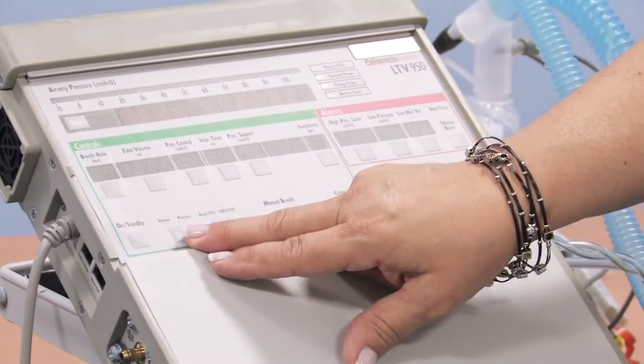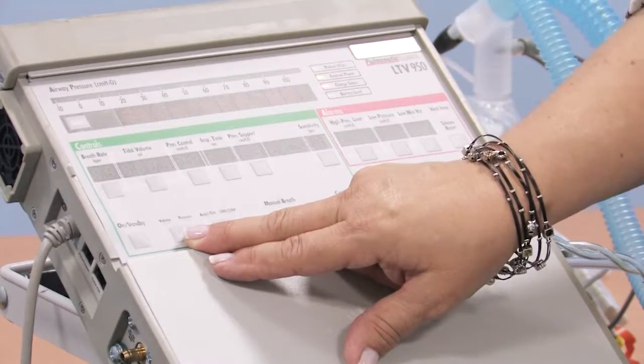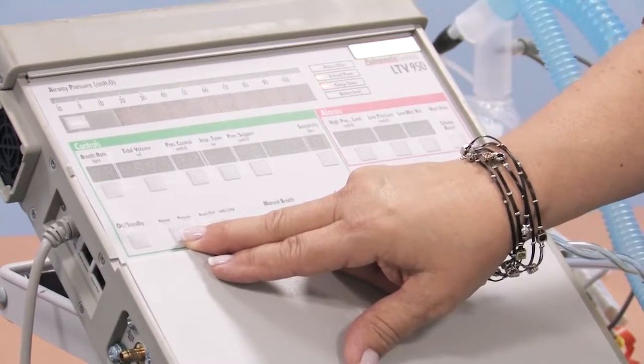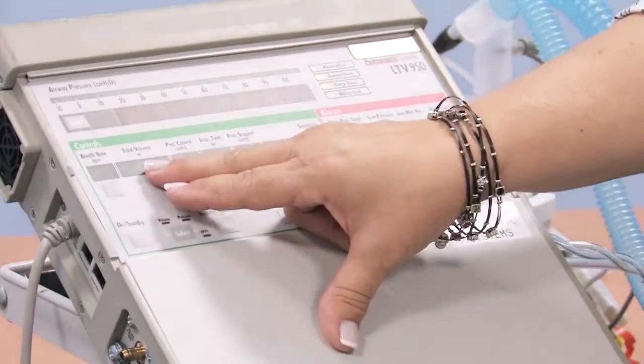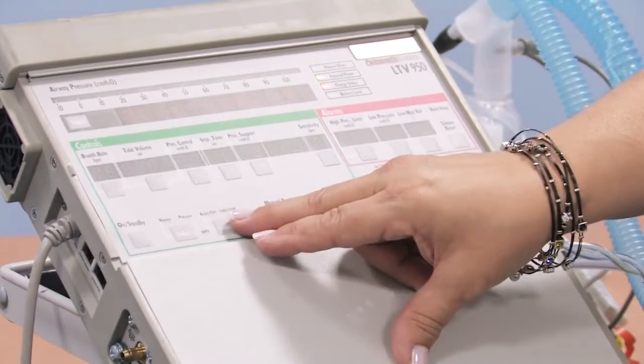If your child is prescribed a volume control breath, meaning that the doctor actually prescribed 300 cc's, for example, a size of a breath that's appropriate for your child's size and weight, then tidal volume will be lit over here. Now, more about modes.